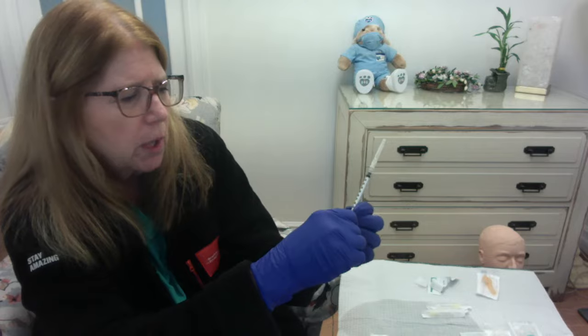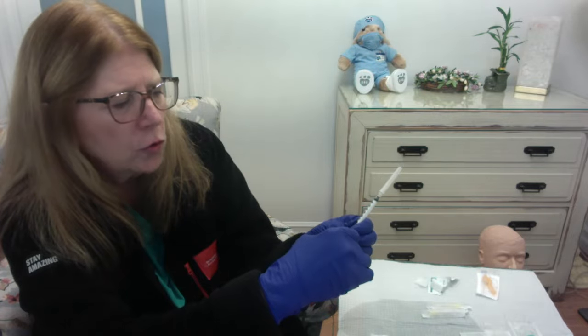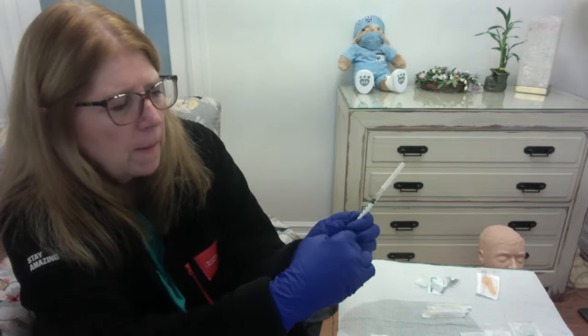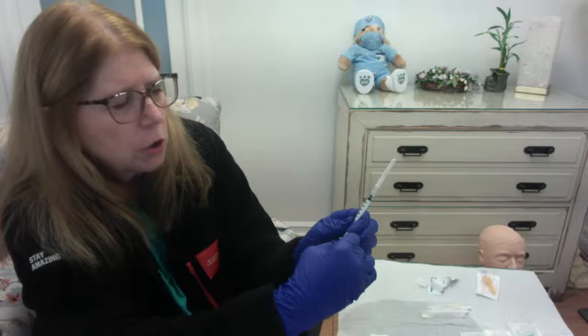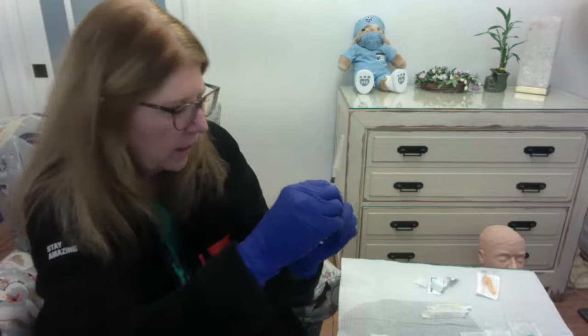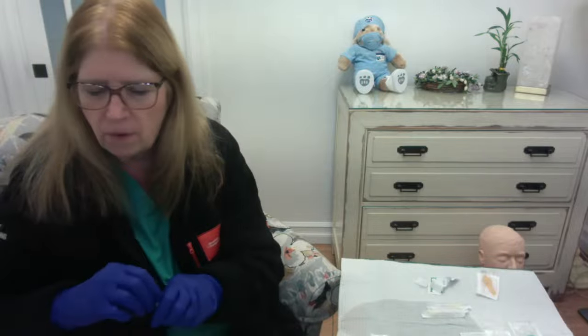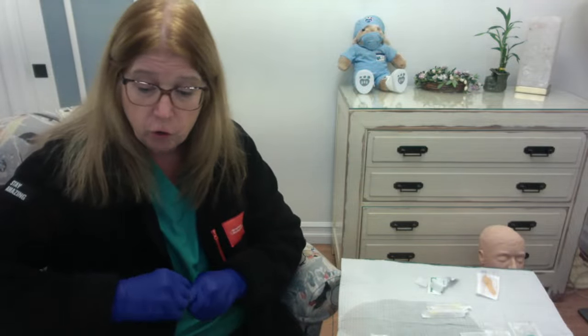So usually the PPD is a very small amount, usually 0.1. Okay, so we can pull our plunger back to that 0.1 to get that air in there. And then we have a vial of PPD solution.